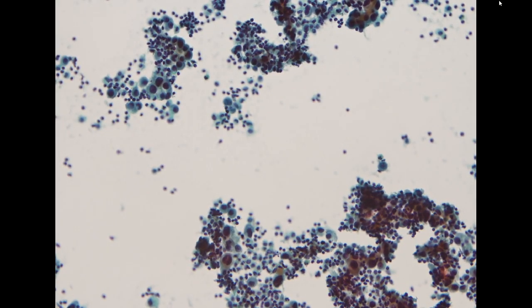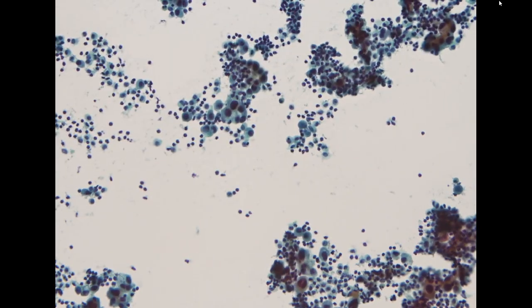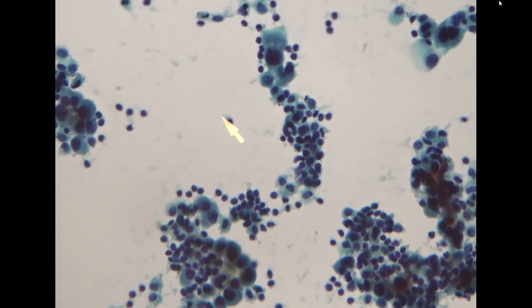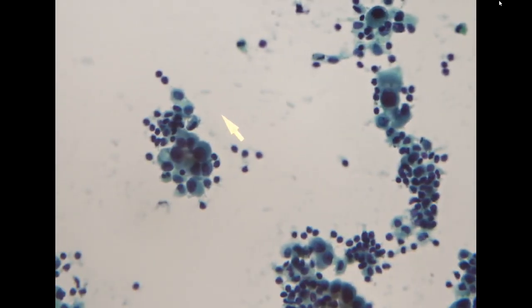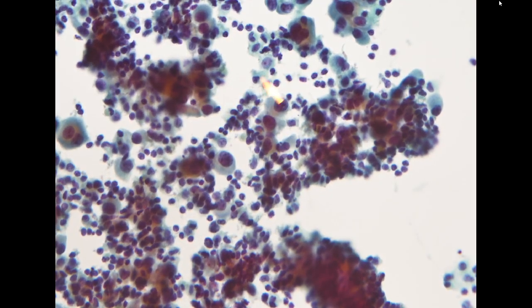we see in the background there are a lot of inflammatory cells. There are some cells in clusters with more epithelial morphology. The nucleus is enlarged. However, it doesn't look like small cell lung cancer at all. So this is kind of strange.